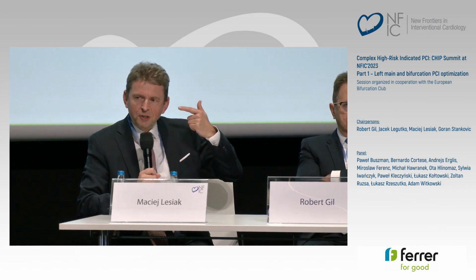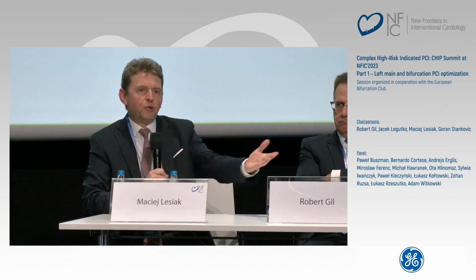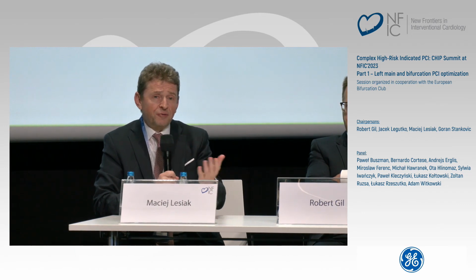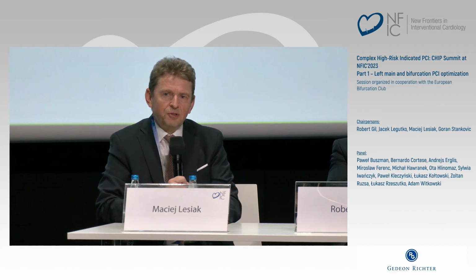If you change your thinking with OCT and stop doing angiography just for angiography, but you do angiography together with OCT, then you can really save contrast. After the procedure, when you do OCT in only one projection, you don't need to repeat projections LAO, RAO, with wire, without wire, so you really can save some contrast.